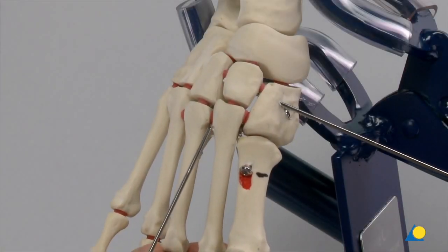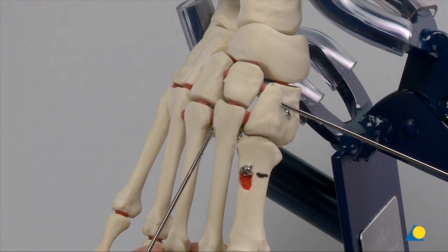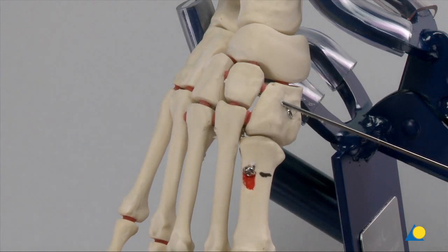As an option, if the second TMT is very unstable, a K-wire can be inserted for temporary fixation, or in the clinic, an appropriate diameter screw can be inserted using the previously described technique. In this case, it is stable enough that a K-wire is not needed.